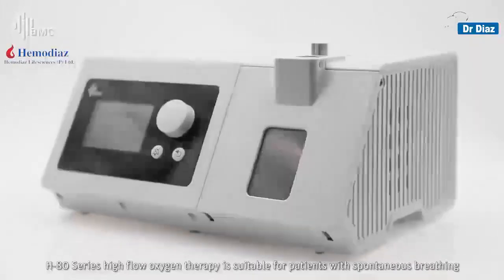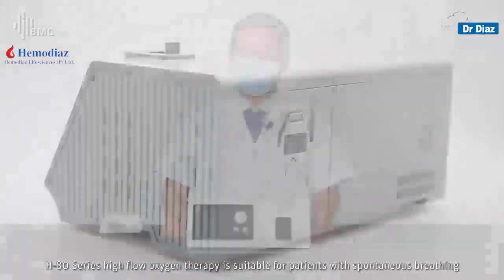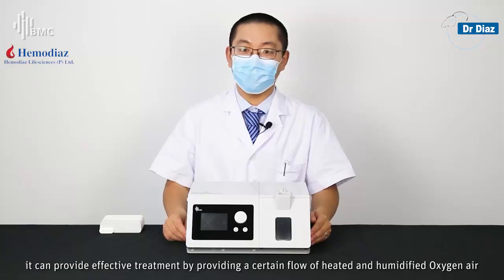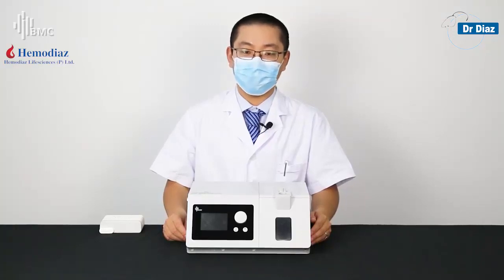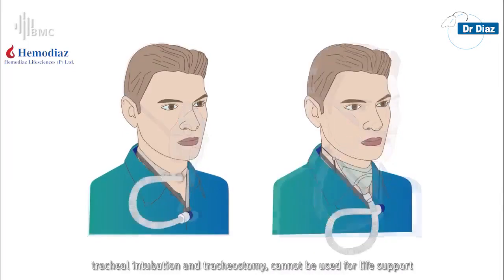The H80 series high-flow oxygen therapy is suitable for patients with spontaneous breathing. It can provide effective treatment by delivering a certain flow of heated and humidified oxygen-air mixture. These patients include those requiring humidification therapy, oxygen therapy, and tracheal intubation.